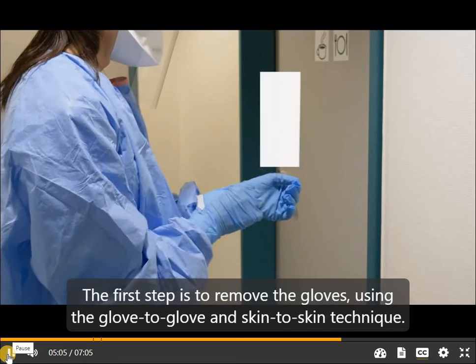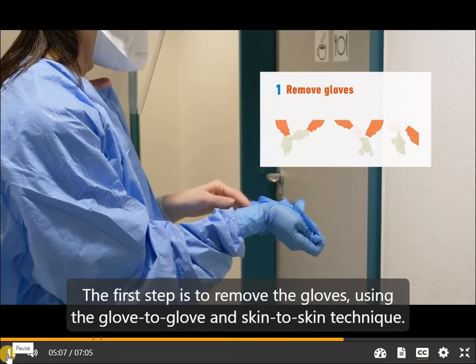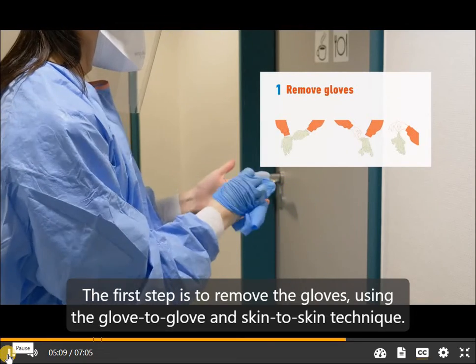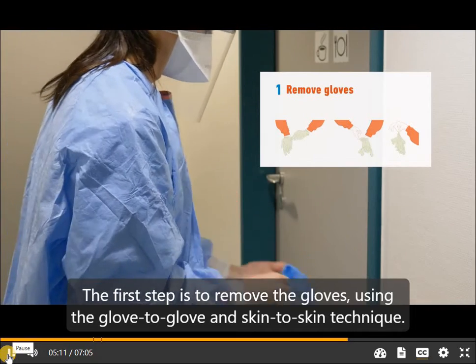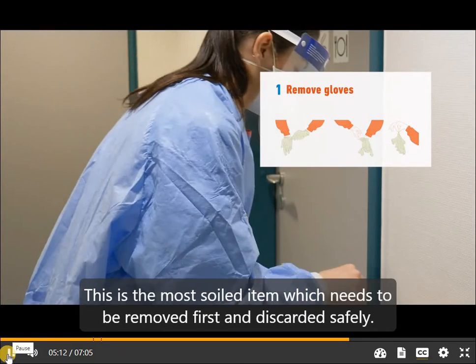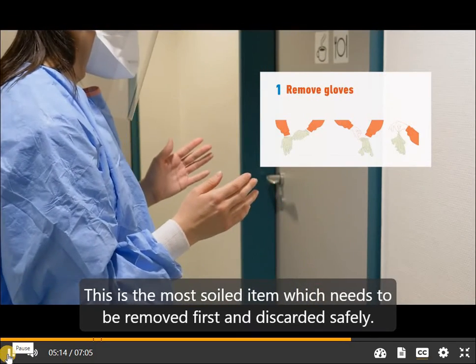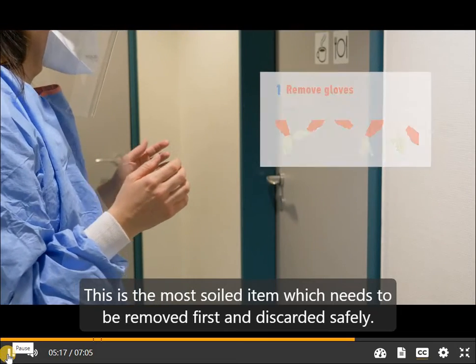The first step is to remove the gloves using the glove-to-glove and skin-to-skin technique. This is the most soiled item and needs to be removed first and discarded safely.